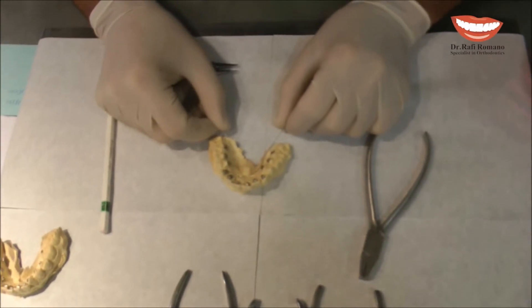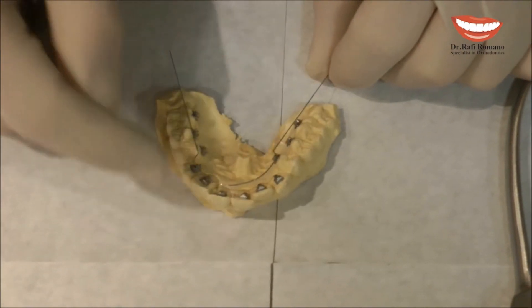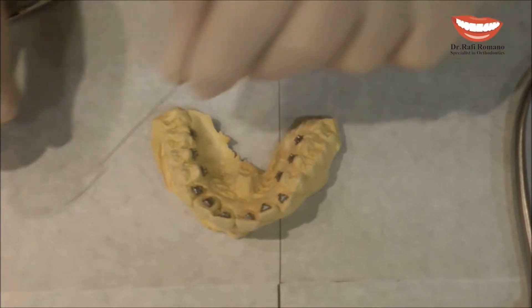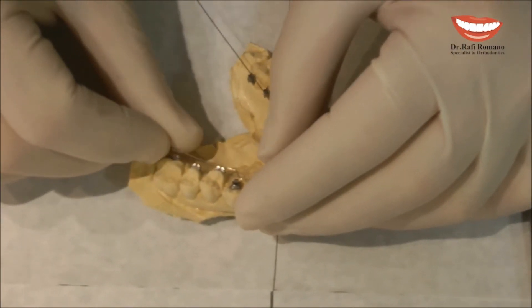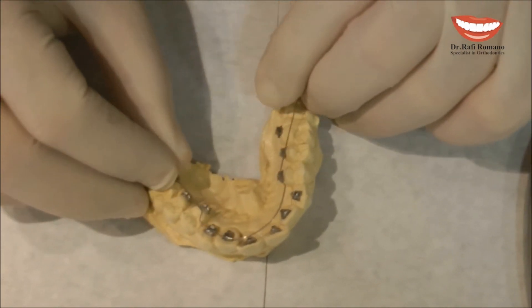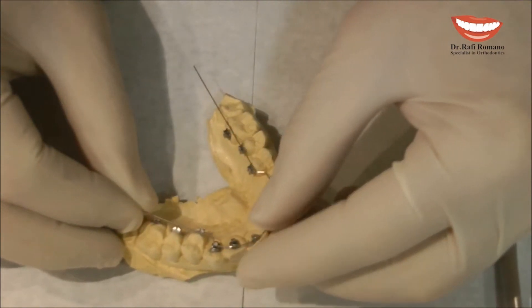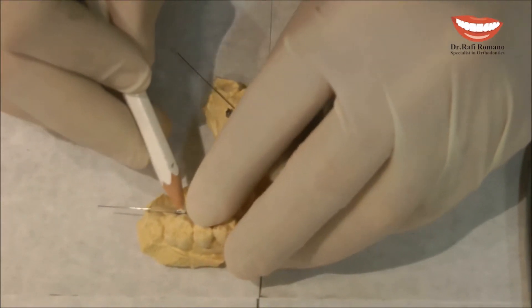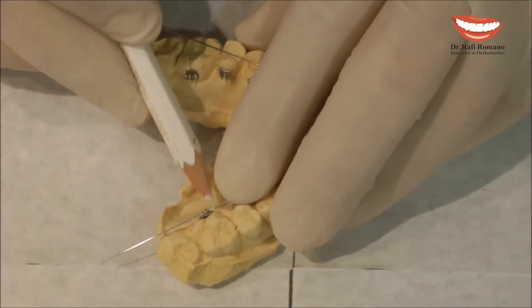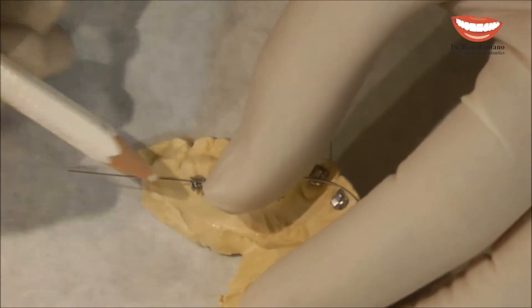Another option, as we said, can be to try to push all the teeth forward, not just the front segment but all the teeth. You can see here the mushroom passive wire that I bended before. And now I want to make sure that all the segments between 5 to 5 will be pushed forward. So what I will do now is take the wire, place it a little forward, then I will go to the mesial of the molar and do a mark. And same, I will do here, and I do a mark.